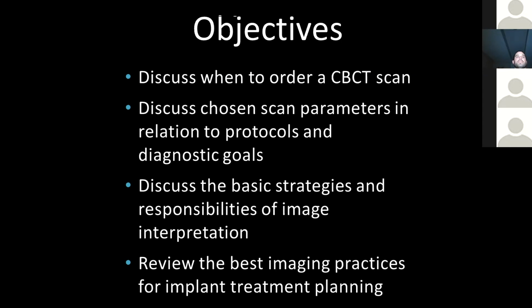I feel like I'm not answering your question very well here. It really ultimately depends on the software. That being said, any given machine, there is a way to manage it somehow, whether that's through a semi-automatic protocol you set up once, or you actually manually select. For example, our iCat machine, we can manually select the resolution, or we can set up an automatic protocol, both, and our techs will use both in different clinical situations. For implant planning, we'll discuss this more next week as well. Most voxel sizes are 0.15 to maybe up to 0.3.